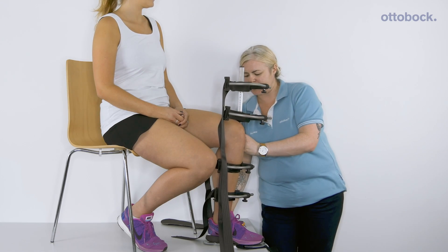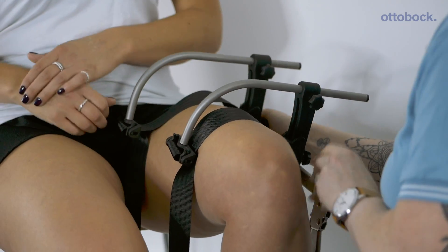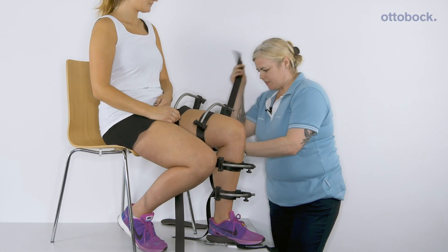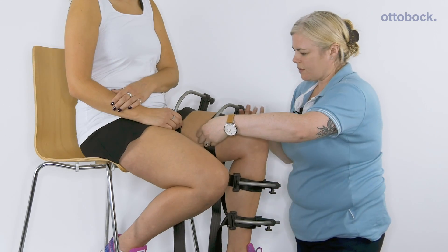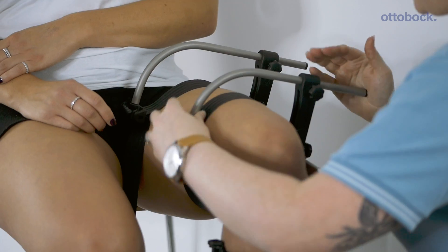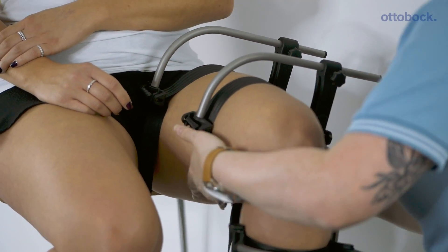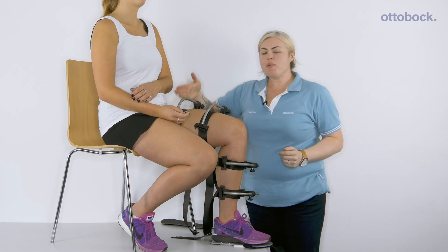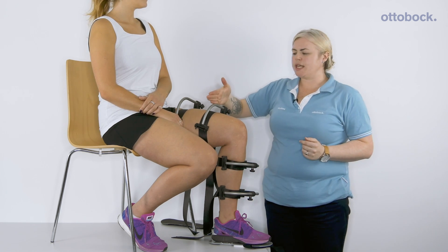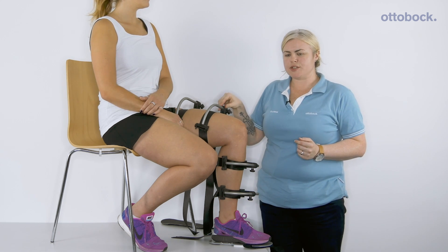Next we will unlock the hinge with the cable and then apply the upper leg. You can adjust the bars once the straps are tightened. The upper bar should be 40 millimetres below the crotch and the lower thigh bar should be at least 80 millimetres above the knee joint center.